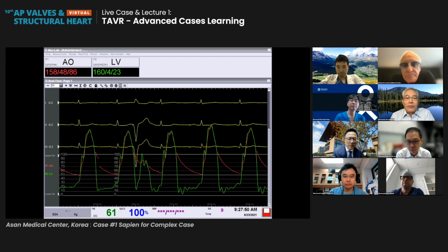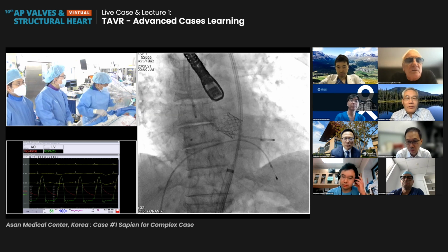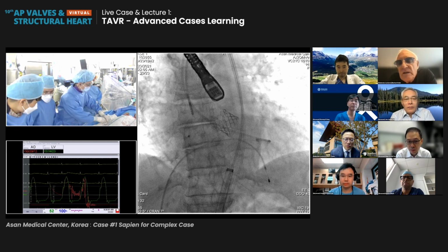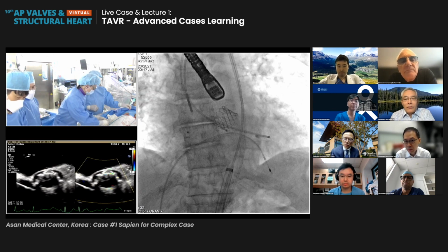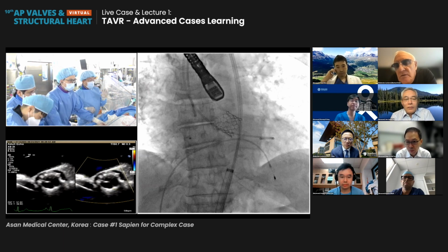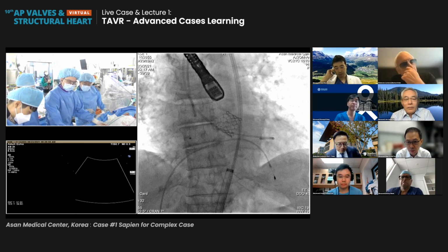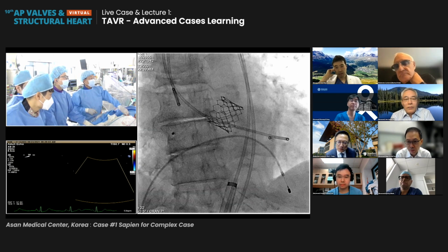All right, great. However, still some dots. Can you please show the TEE? I want to check that the valvular opening is really good and there's no paravalvular leakage and AR. Okay, great. Well, can we still do an angiogram? Because before the pullback of the pigtail wires, I'd like to do an aortogram first. All right, ready? Okay. Yes, ready. All right. Injection.